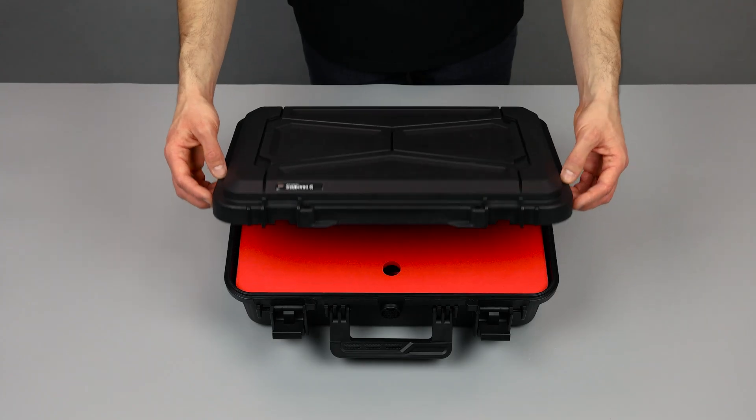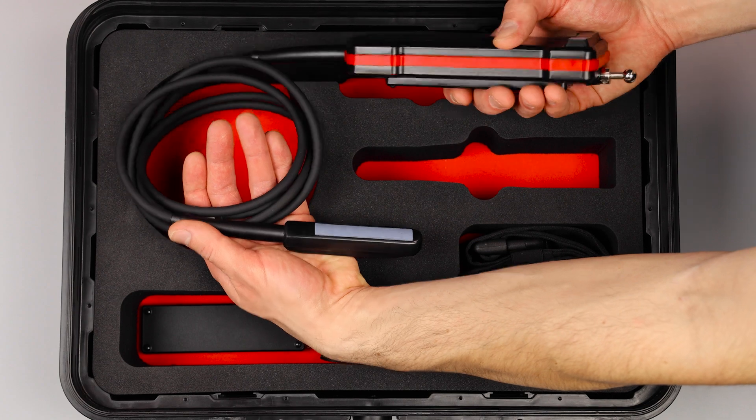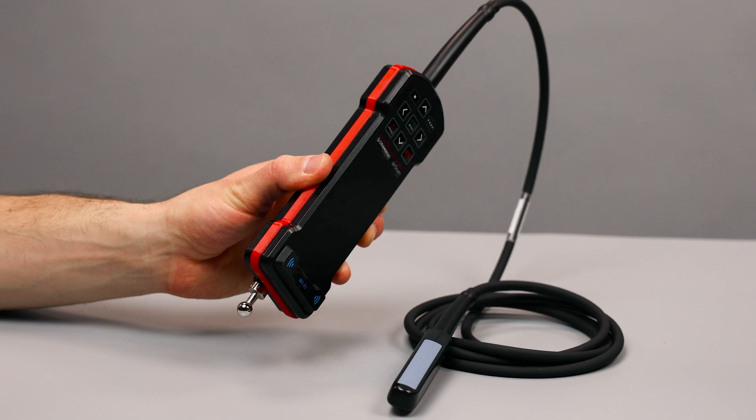The set comes in a sturdy transport case with foam inserts, so you don't have to worry about your equipment. Inside you will find AirScan Pro, a new lightweight and wireless ultrasound scanner enclosed in a waterproof aluminum housing.